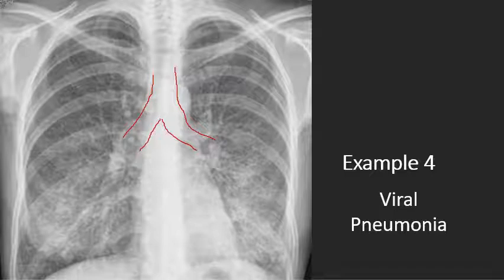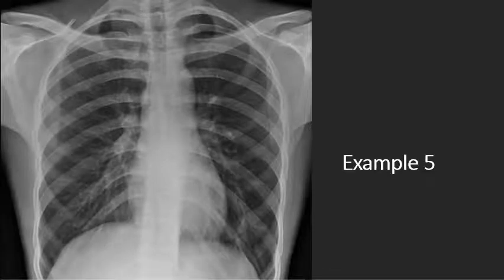And another thing that you have to worry about is that if the patient doesn't present poorly and they do still have this X-ray, then you need to be concerned on day 10 to 20. If the patient is not doing so well and then they just kind of crash out, then it may be a bacterial superinfection with staph or strep. That's the time that you need to keep in your mind's eye that we've reached the limit where you might have a superinfection from the viral inflammatory processes that have destroyed the cellular boundaries that existed beforehand.